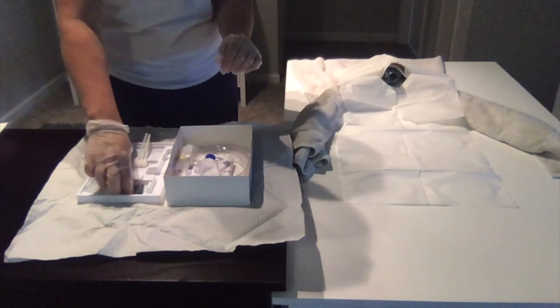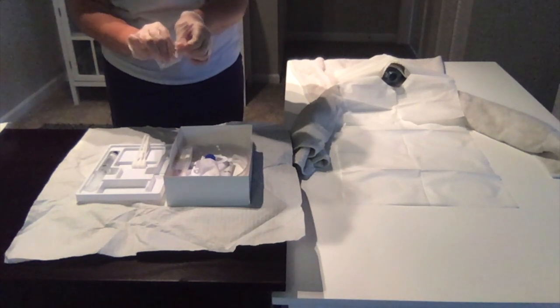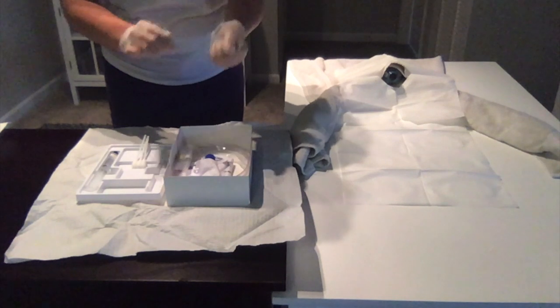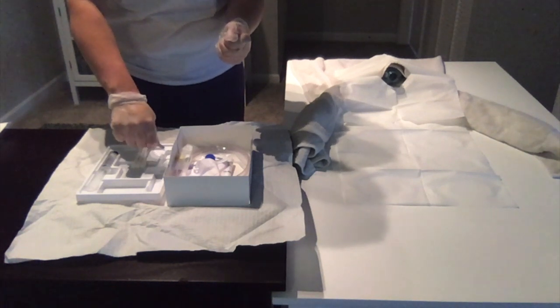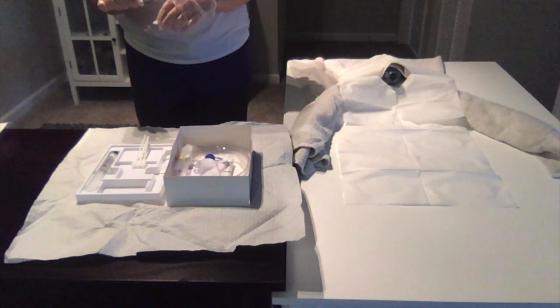And then I'm going to take my lubrication. I can go ahead and squirt it in here. Okay. So then also maintaining height, I can drop it in the trash that's below me.